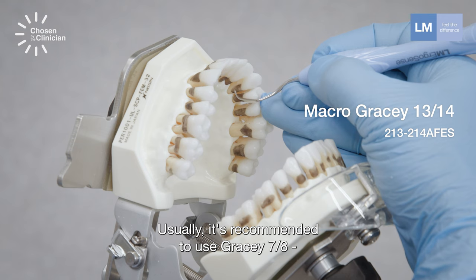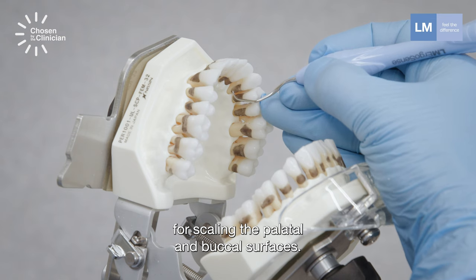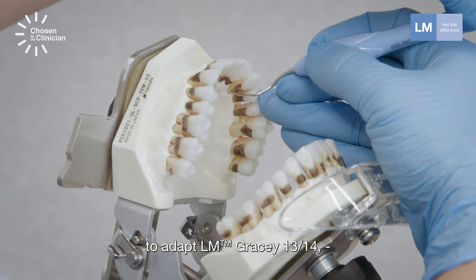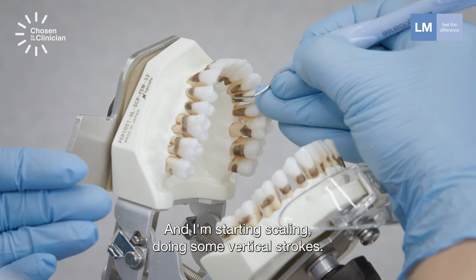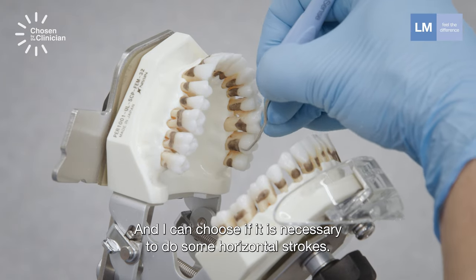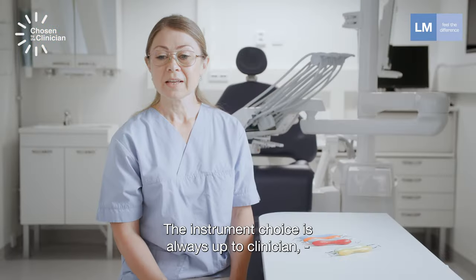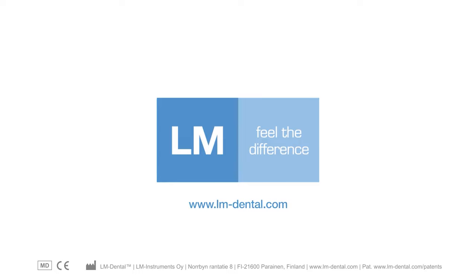Usually it's recommended to use Gracey 7-8 for scaling the palatal and buccal surfaces. Nevertheless, it's much easier for me to adapt Gracey 13-14 because of the quite curved palatal roots. I'm starting scaling doing some vertical strokes, and I can choose if it is necessary to do some horizontal strokes as well. The instrument choice is always up to the clinician, but there are so many excellent options.